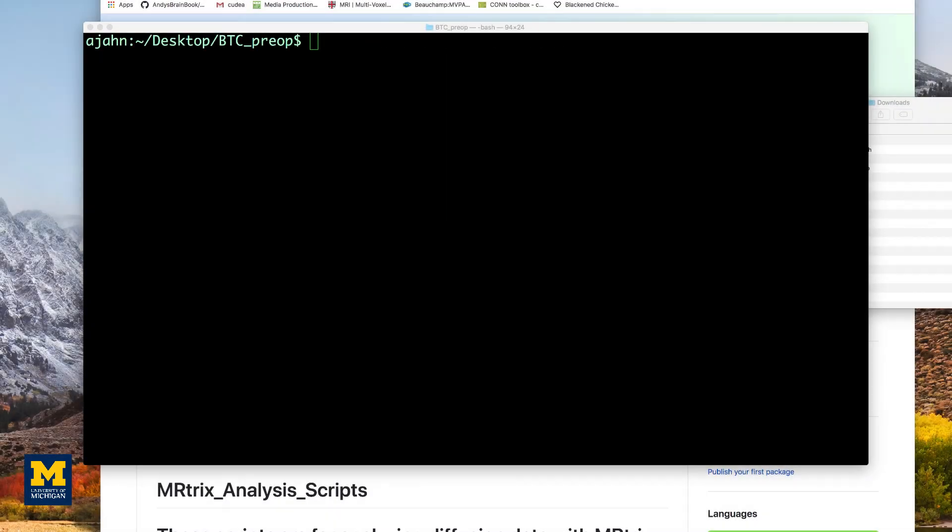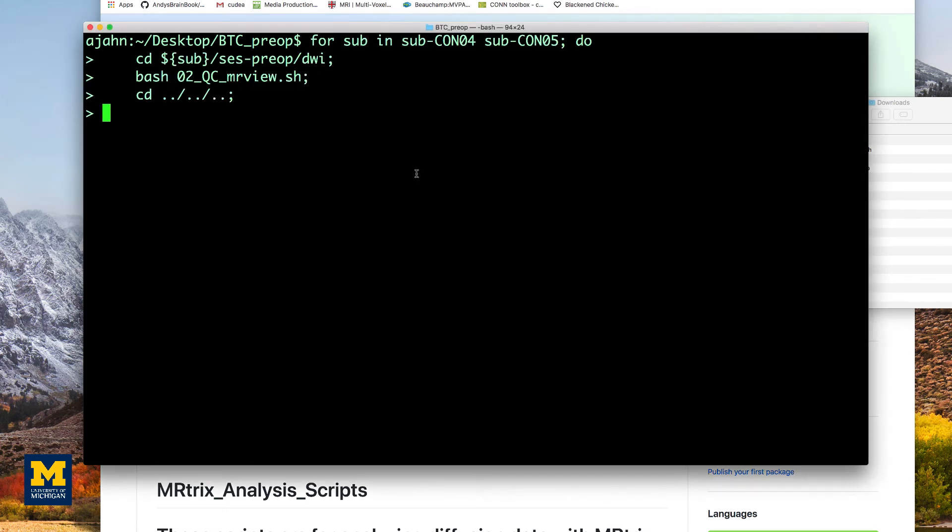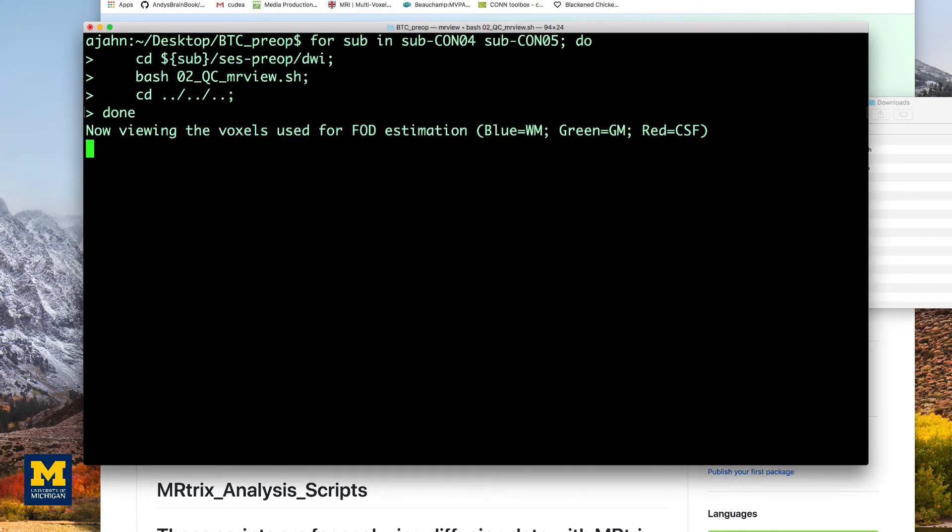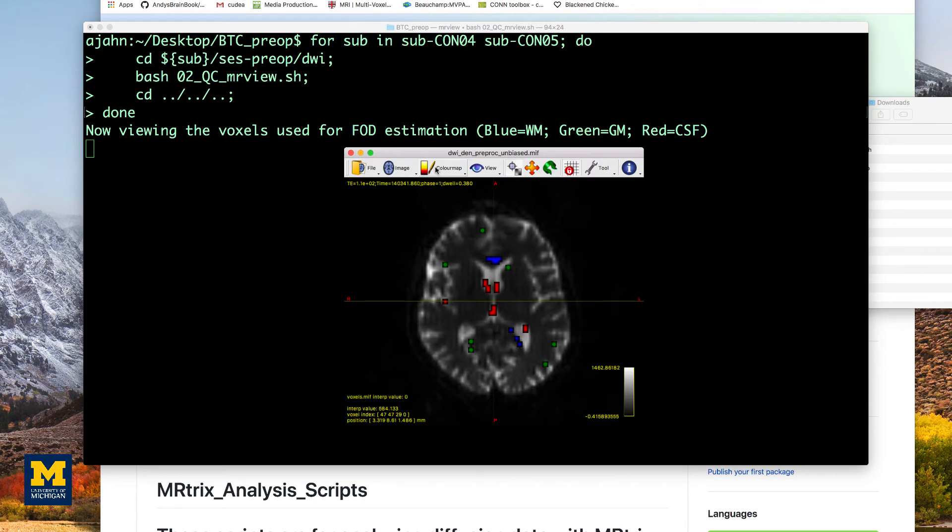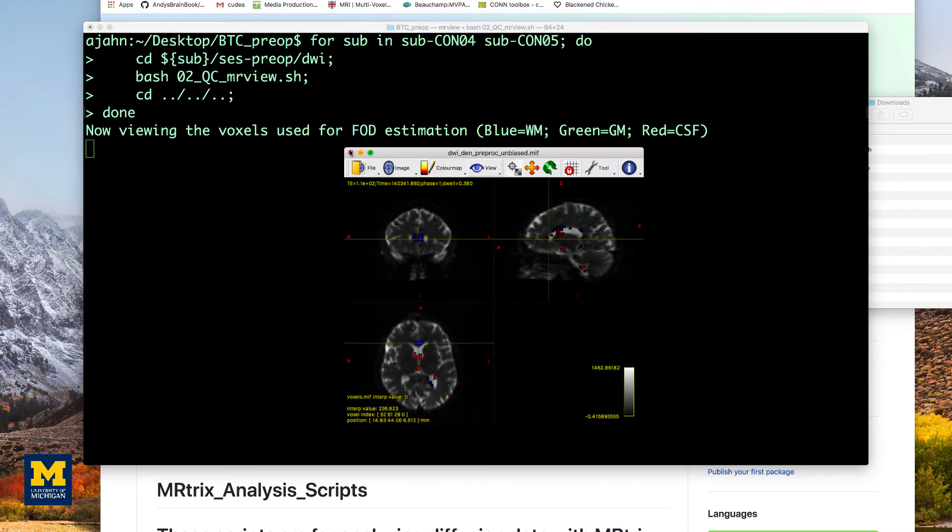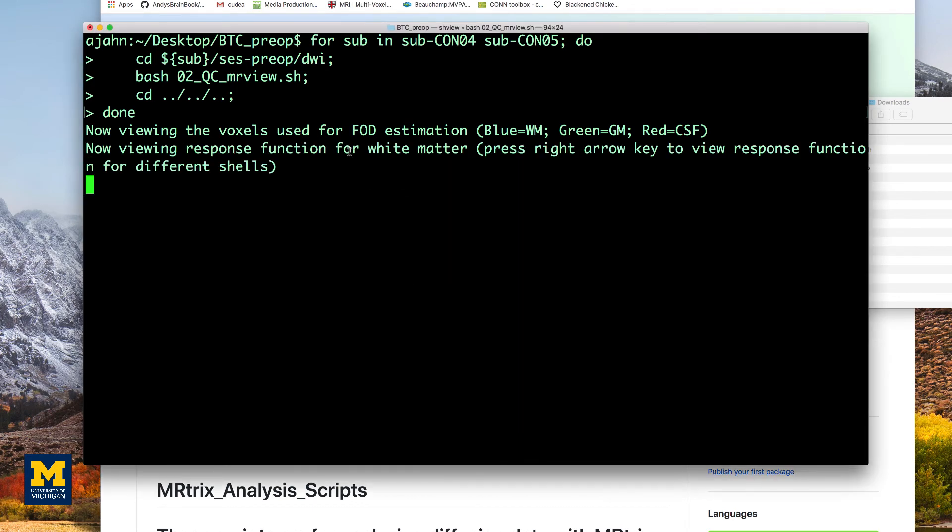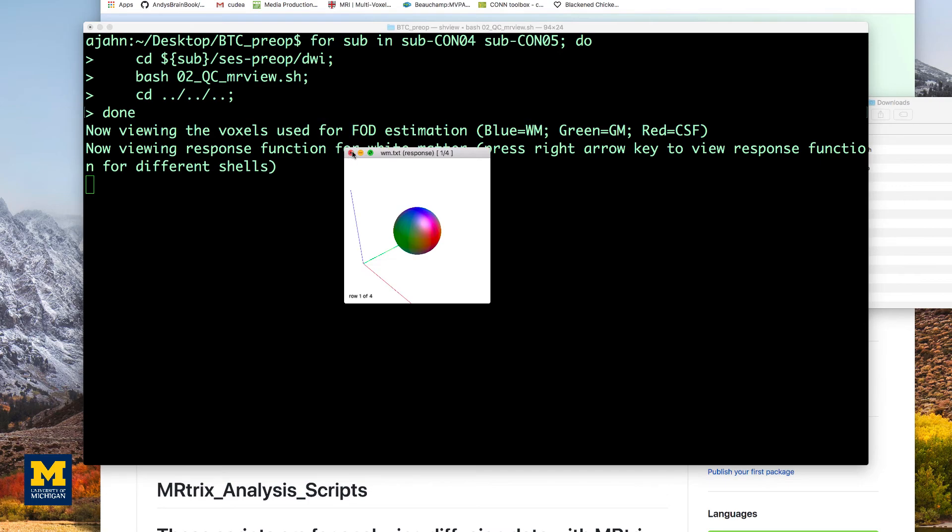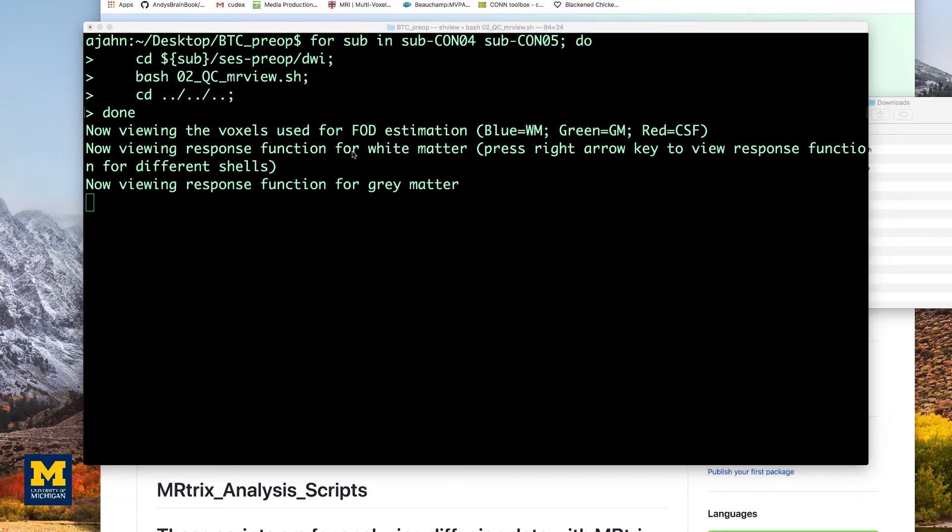When that has finished, we will use the same loop to run the QA checks. This allows you to check the output from all the steps. We won't go over all the QA checks again here, but see the link down below for a review on how to do this.